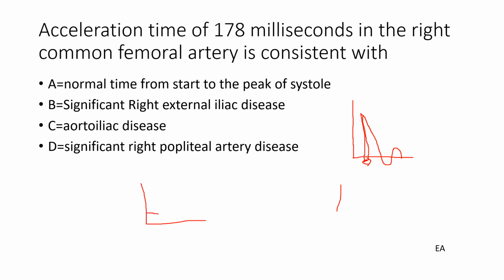We have a point of systole that goes very slowly to peak systole, and then end of systole and diastole. So the acceleration time is from here to here.